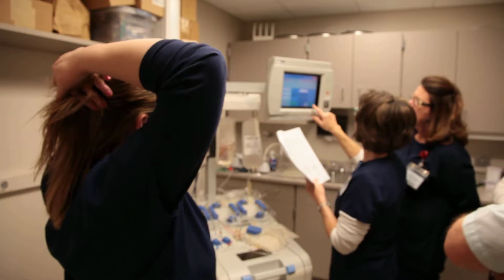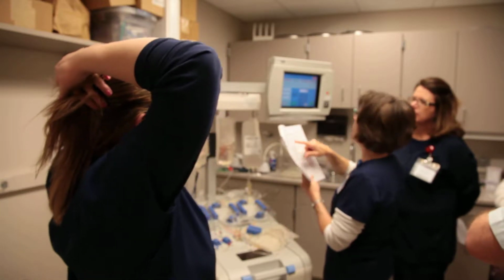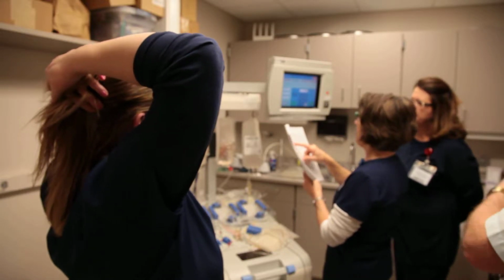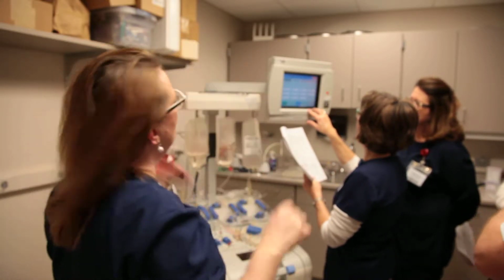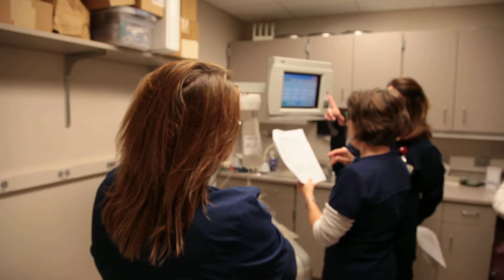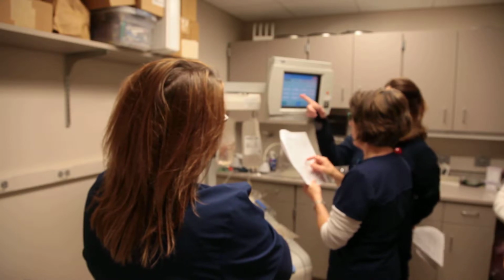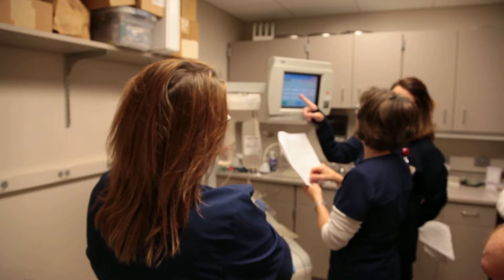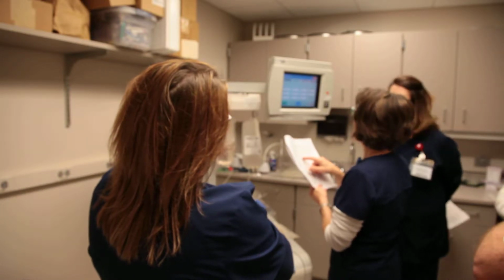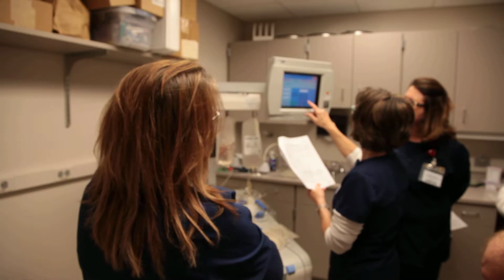And we do use a heparin ACDA cocktail also, but it's different than our regular one. We take 500 mLs of ACDA and 500 mLs of normal saline in a 1 liter bag. And then you add 10 units per kilogram of heparin. To point out here, it says 2.1, but when we start it, if it doesn't get up to the rate, which I think is 2.5, then we actually have to go back and change this, but we can't change it any higher than 2.5. But you'll see as we go on. Right now you start it out at 2.1. Some patients, if they're big enough, it'll work at 2.1 and get 2.5.